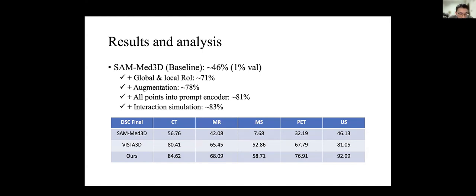Here are our results on the validation set. You can see that our model achieves better performance than SAMMed3D and Vista3D, which our model is based on.